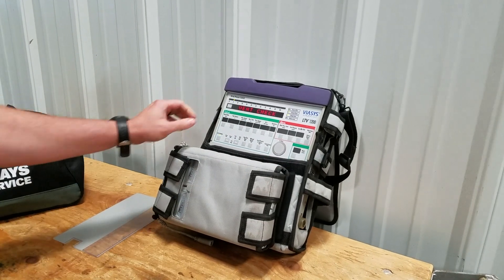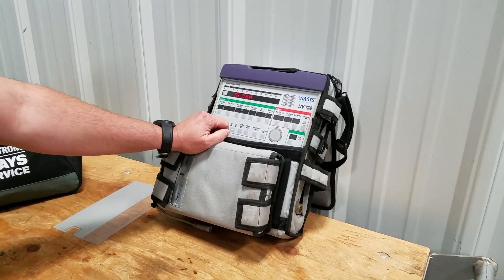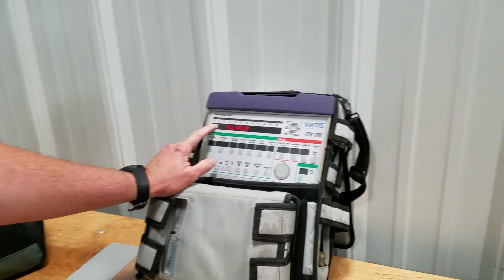This is where we want to start. We're going to go ahead and hit select. The first thing it's going to pull up is the alarm, so when we press the select button we should hear the alarm go off.